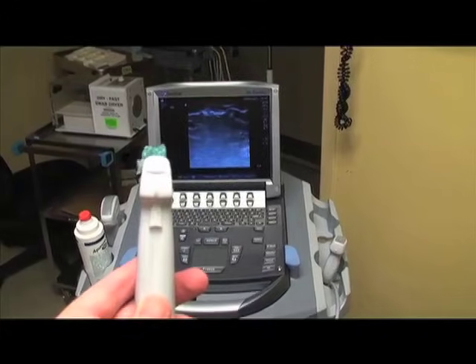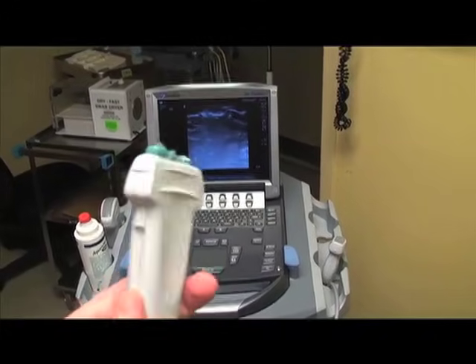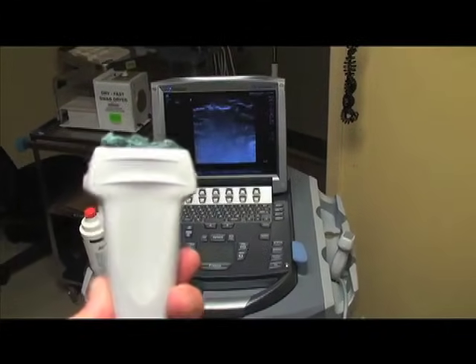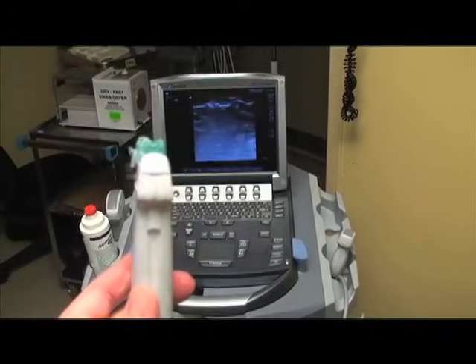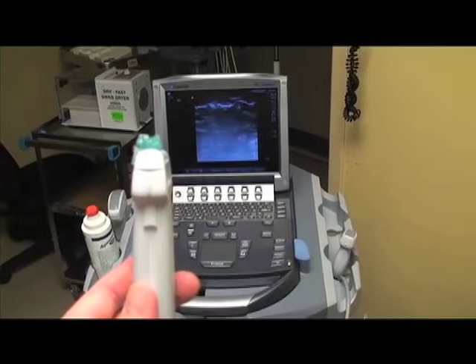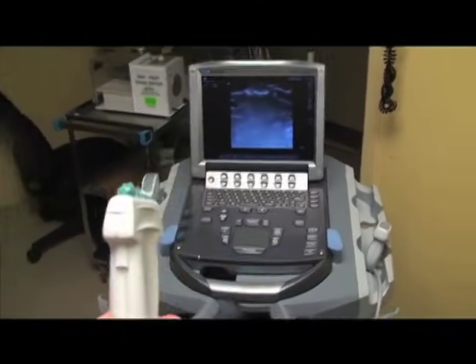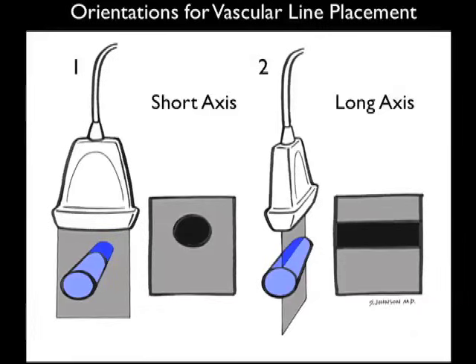Here's the high frequency linear type array probe that we'll be using to best map out the internal jugular vein before puncture attempts. Notice the probe marker there to the side of the probe. Here are the orientations that we can place the high frequency probe in relation to the internal jugular vein for vascular line placement.